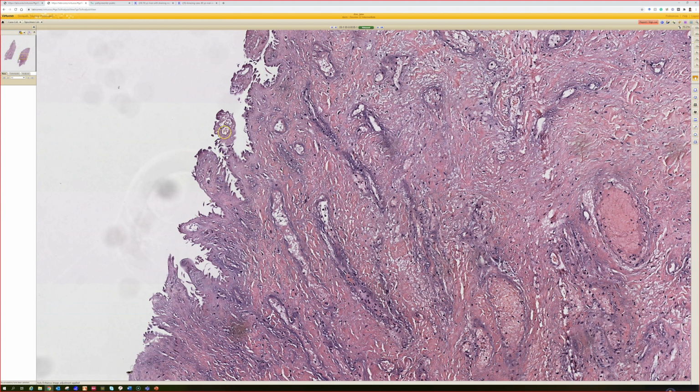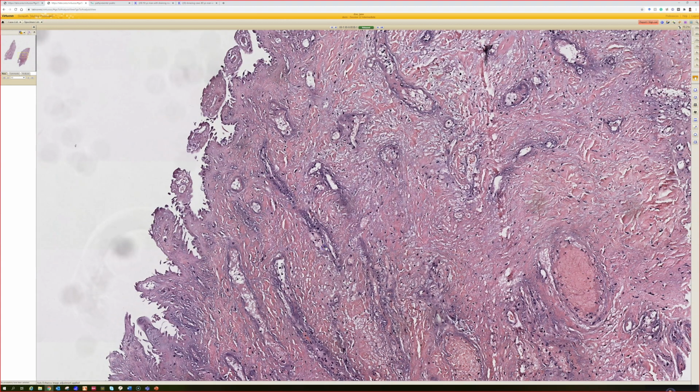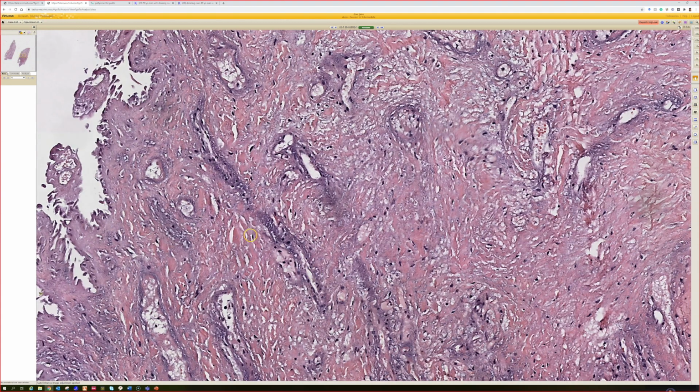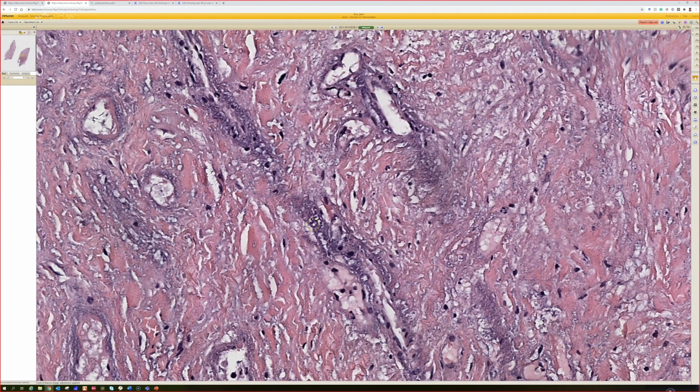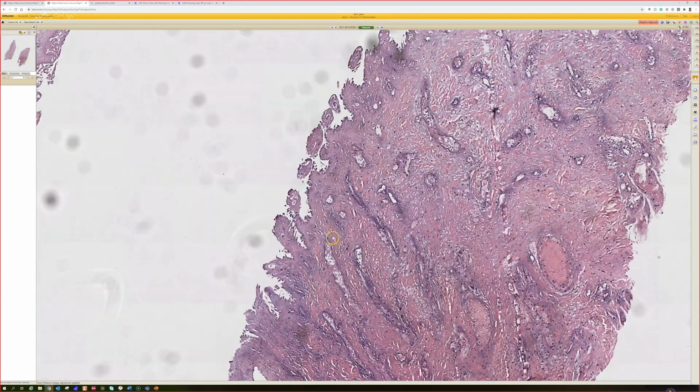The epidermis has died enough that it detached and broke free and sloughed away. The dermis looks like it is on death's doorstep, and the vessels are surrounded by that thick blue coat of Pseudomonas aeruginosa bacteria. You can't see really the individual distinct bacteria here. I'm not even sure if you can on a gram stain. Again, I've never actually seen an example of that. But my recollection is that Pseudomonas organisms are quite small. And so, gram-positive cocci are hard enough to see, and I would imagine that Pseudomonas individual organisms would be even harder.